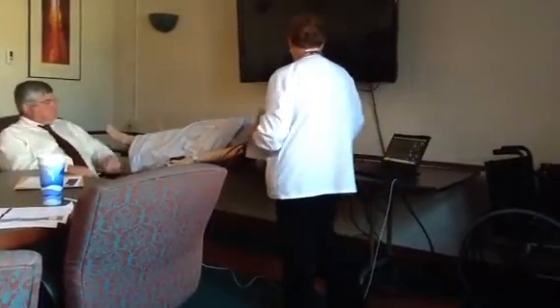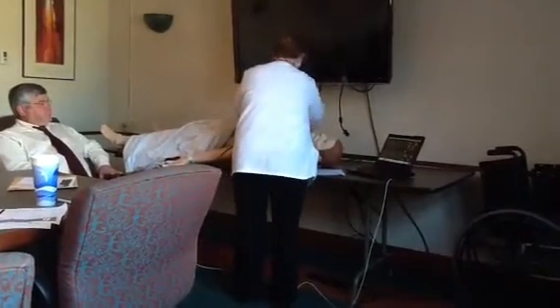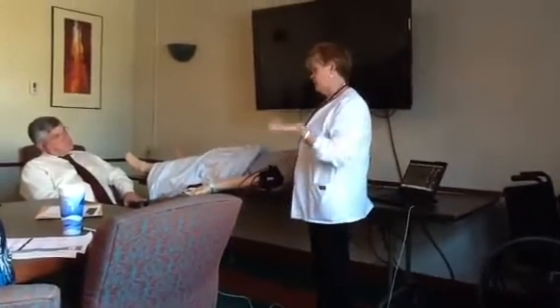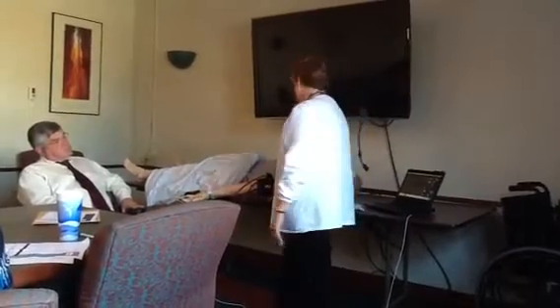Very cool. Let's see, head to toe. So you can do sternal intraosseous, which we would never do, but if you had a medical student or maybe one of our residents that come would want to practice on that, they can do that.